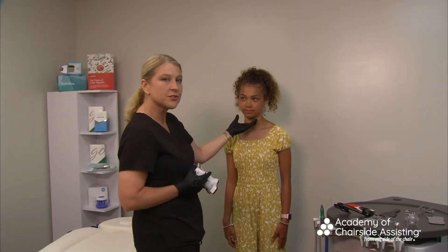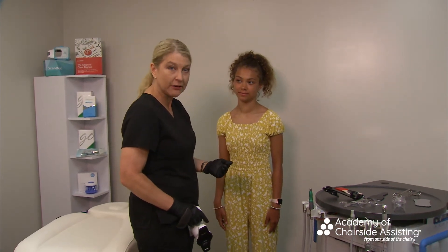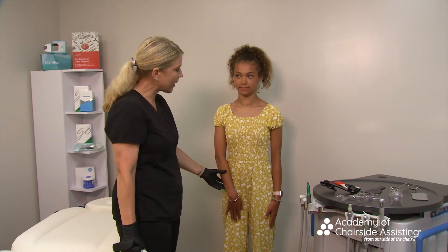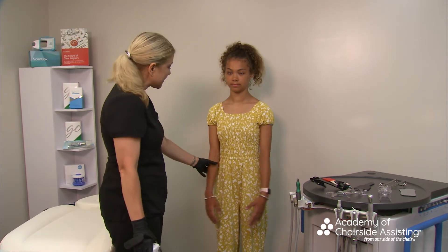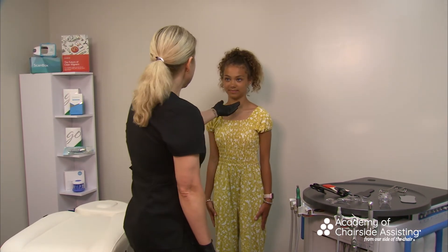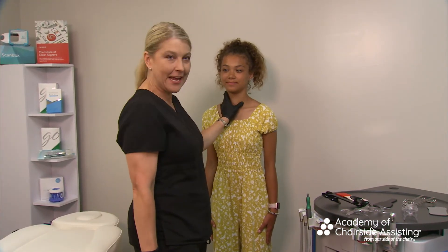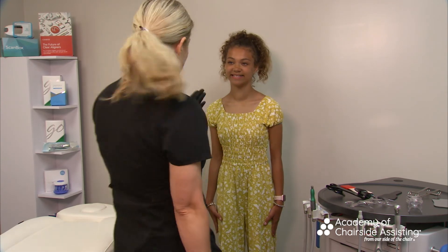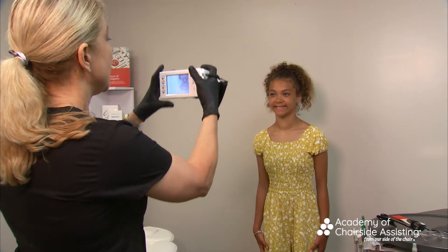Notice Kylie wants to tilt her head — a lot of patients do that. Tell her what you're looking for: hold your head straight up, just like that. Notice her hands are by her side — when patients hold hands in front, their shoulders can shift and cause a head tilt. Keep hands beside you. Also lift the chin slightly; for older patients having them stick their head forward slightly gives a nicer profile.